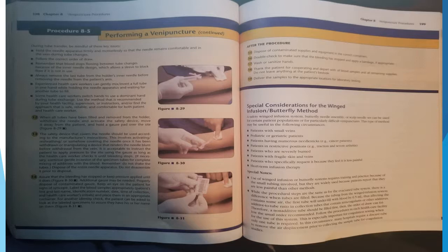Special considerations for the winged infusion butterfly method. A safety winged infusion system, butterfly needle assembly, or scalp needle set can be used for certain patient populations or for particularly difficult venipunctures. This type of method may be useful in the following circumstances: patients with small veins, pediatric or geriatric patients, patients having numerous needle sticks, such as cancer patients, patients in restrictive positions, such as traction and severe arthritis, patients who are severely burned, patients with fragile skin and veins, and patients who specifically request it because they feel it is less painful.